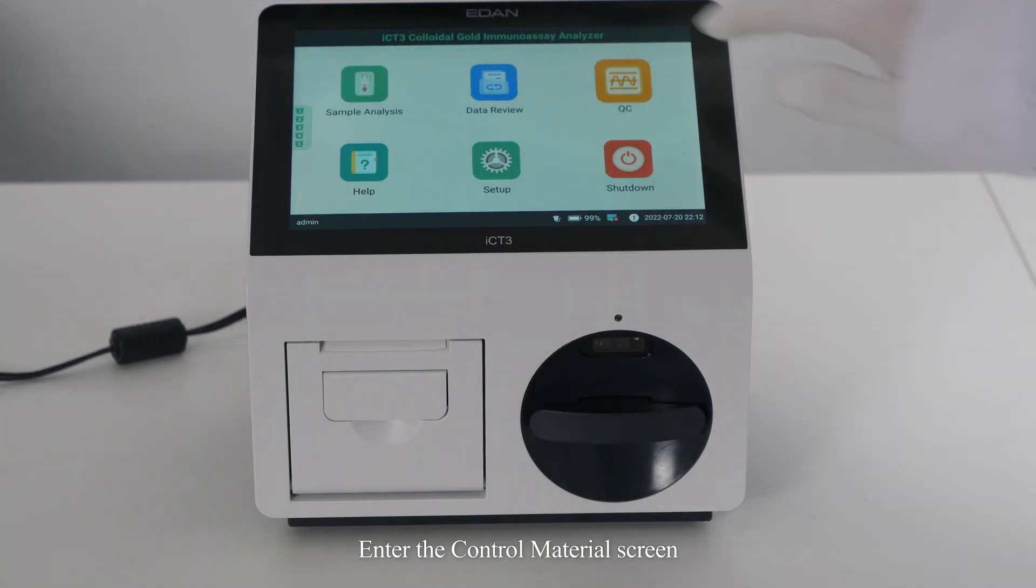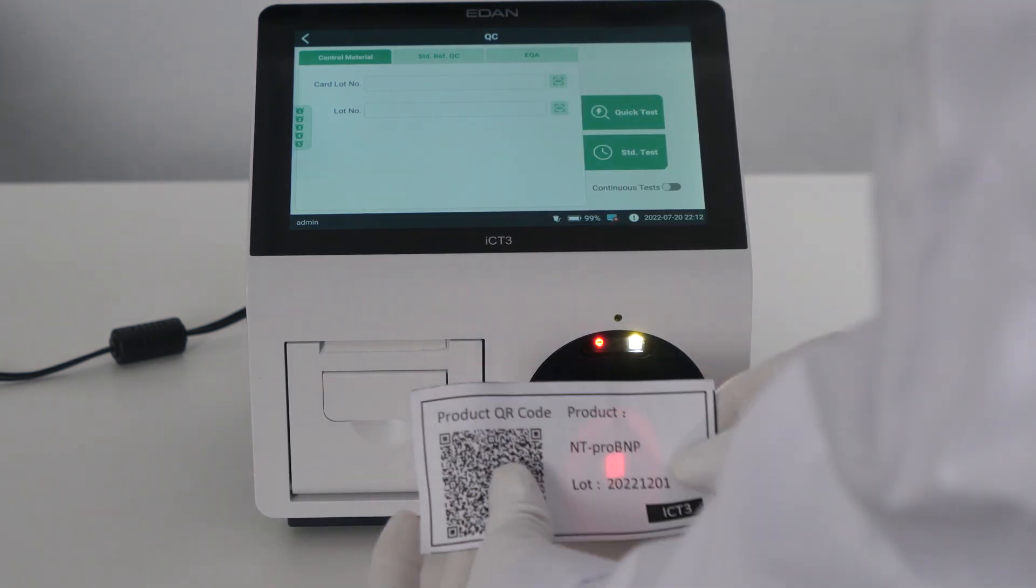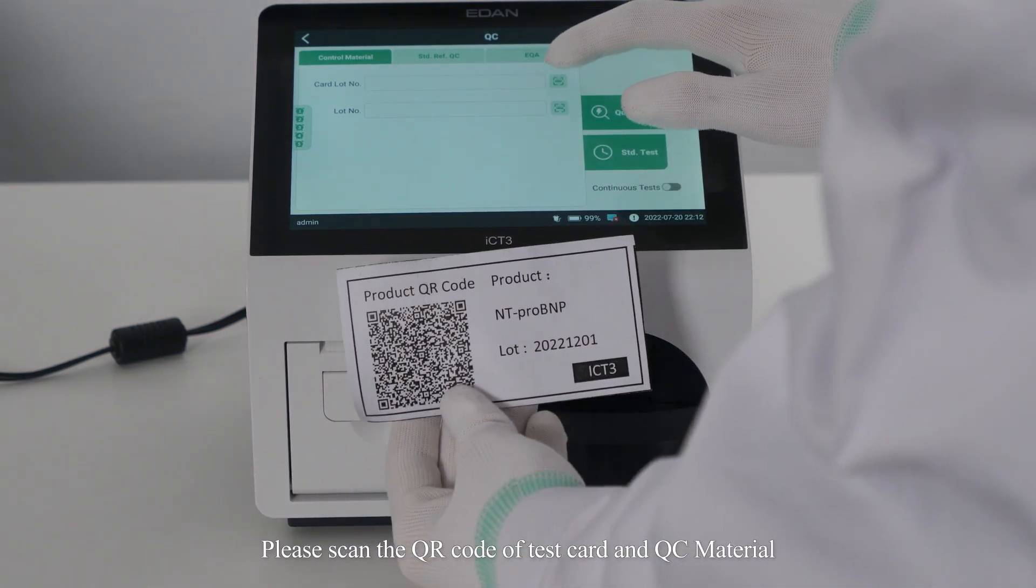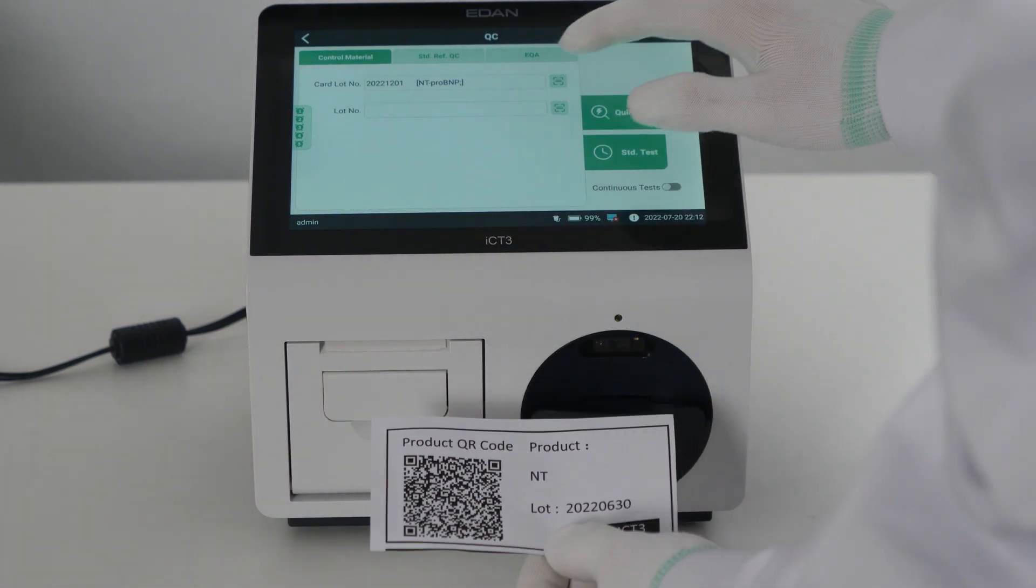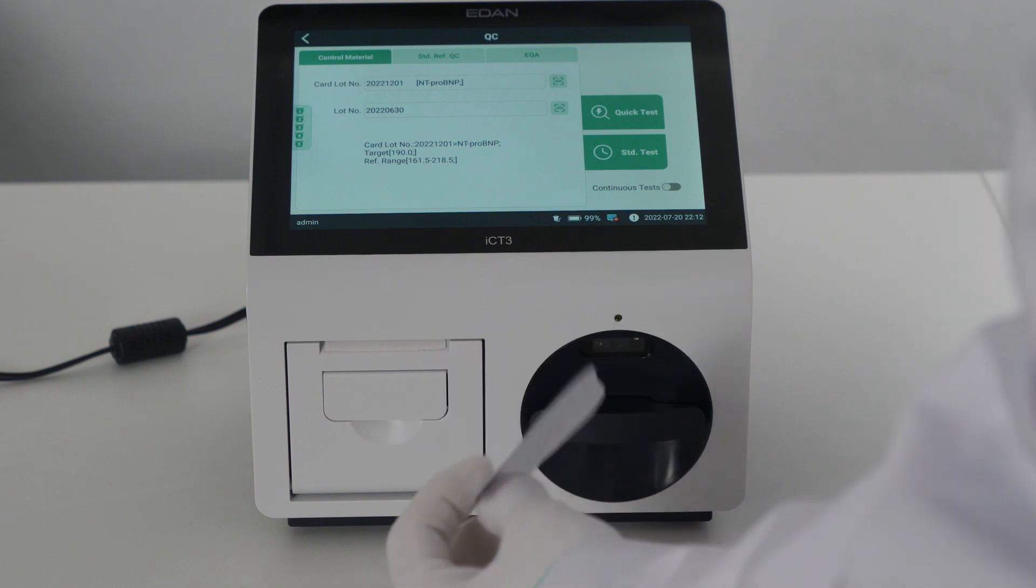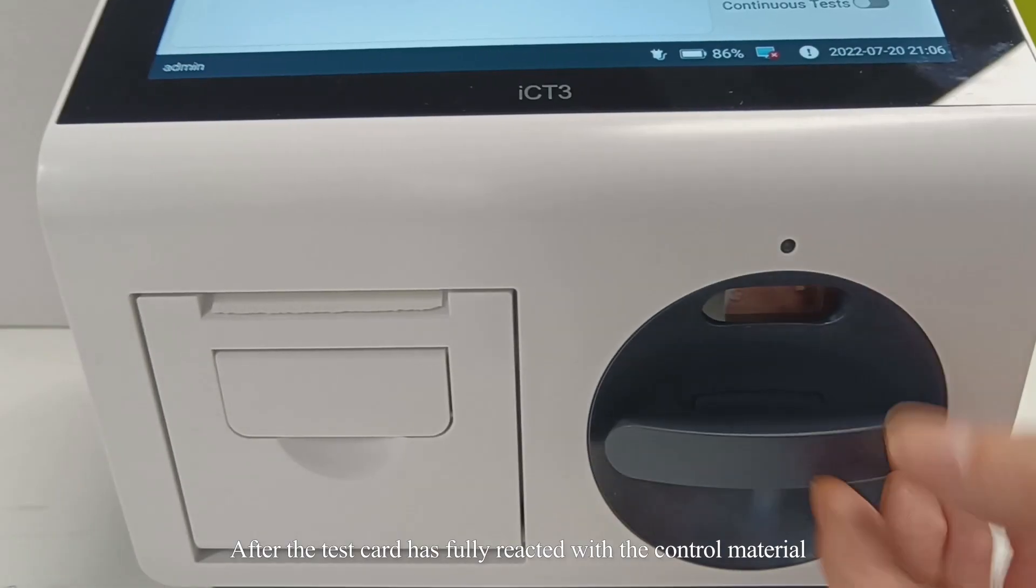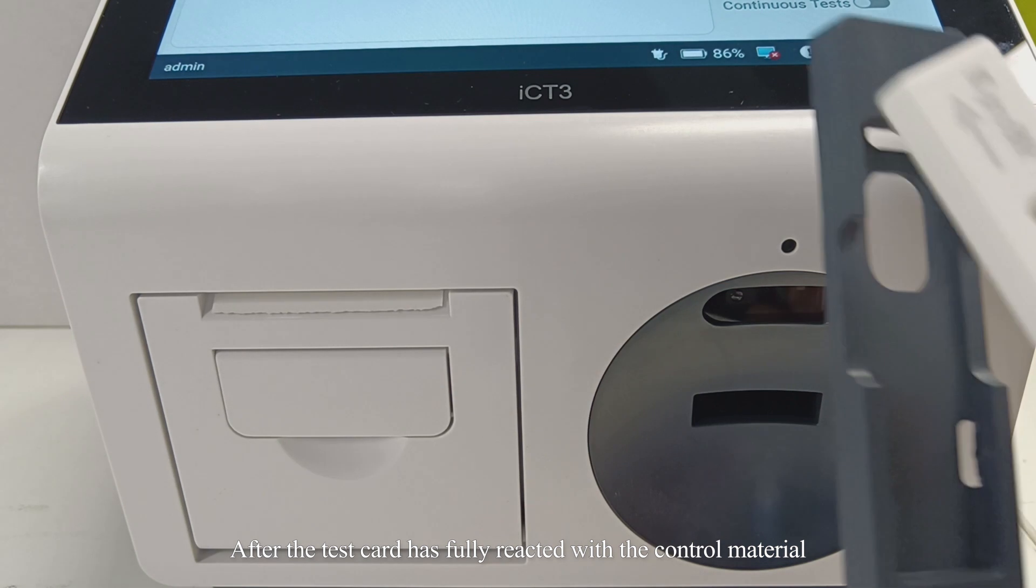Enter the control material screen. Please scan the QR code of test card and quality control material. After the test card has fully reacted with the control material.